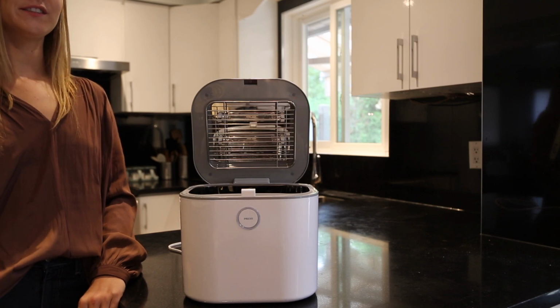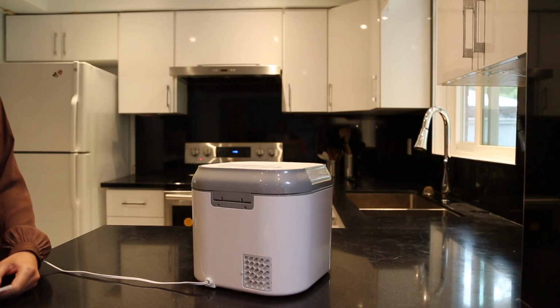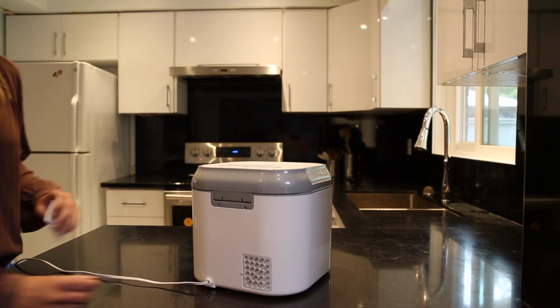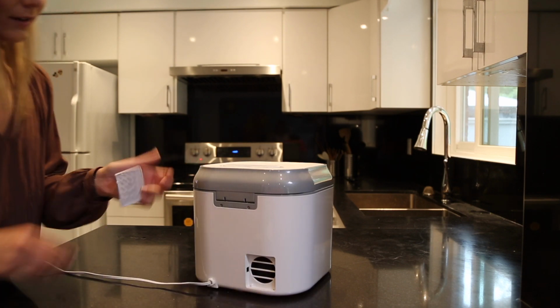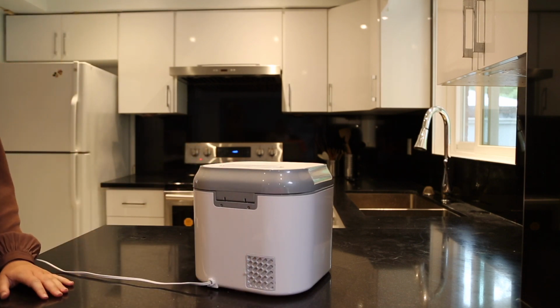Before you start any maintenance for the machine, make sure you unplug it. Maintenance for the Coral UV is very simple. If you are using it daily, you will need to change the filter every 3 months. This is found on the back. You just take it out, put a new one in, and throw away your old one.